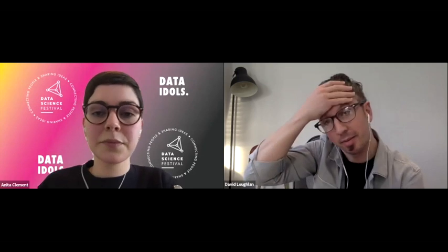So I'm not too far from that, obviously, but as I said, I'm not sure how well my model generalized because I just trained it on a specific data set. It might actually even be biased because all those images are coming from the same hospital, so they might have been taken by the exact same machine, and this could be an issue.